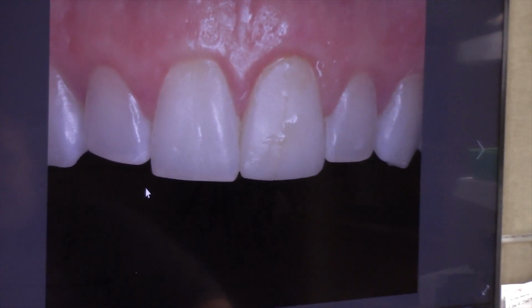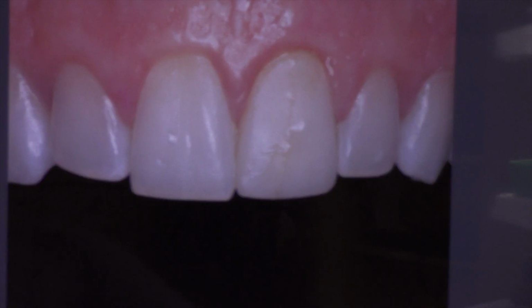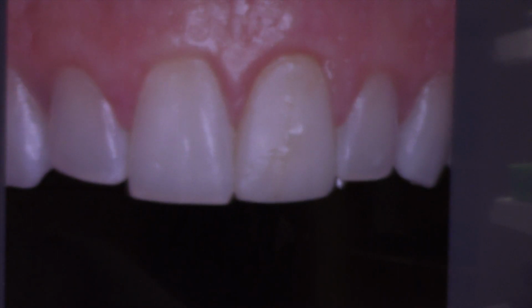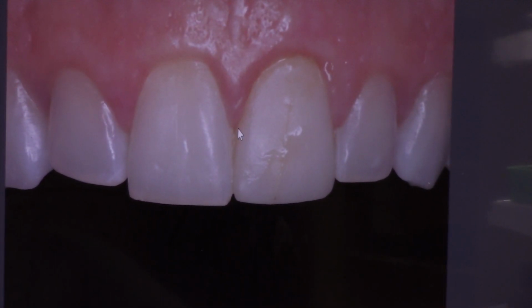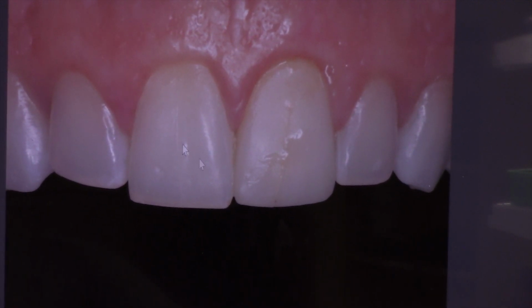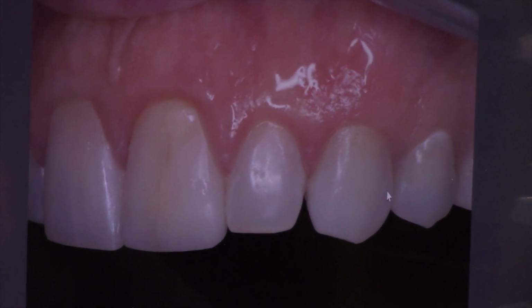Yeah, these are awesome. For one, it gives us a lot of the characterization that a tooth has naturally. We can see where everything starts and stops, dimensions. It really gets into what we're looking for in color, line angles, the way the light refracts, and very, very useful tool.